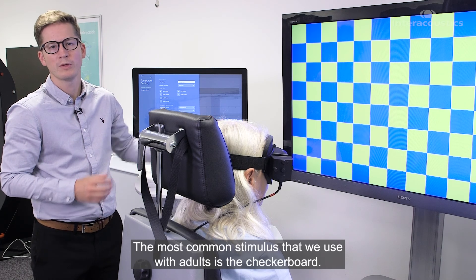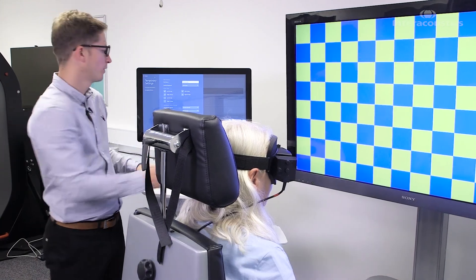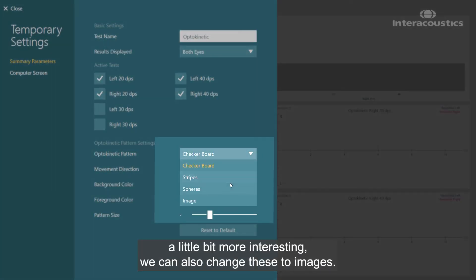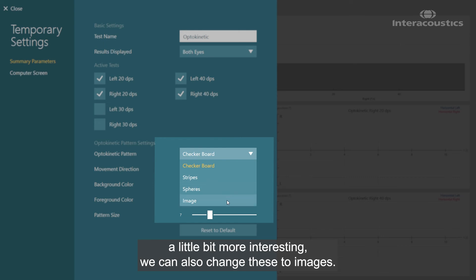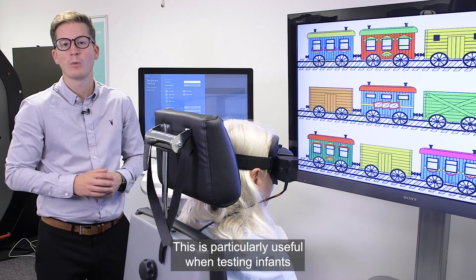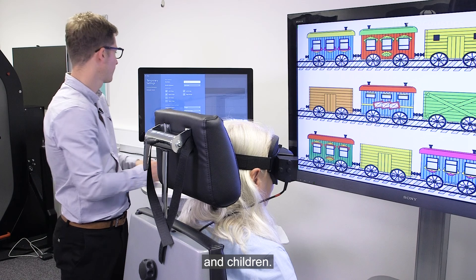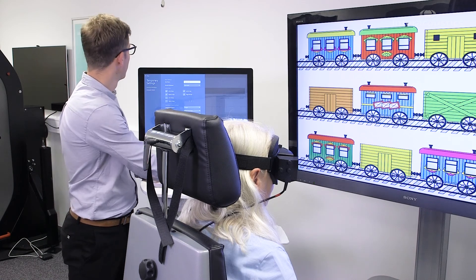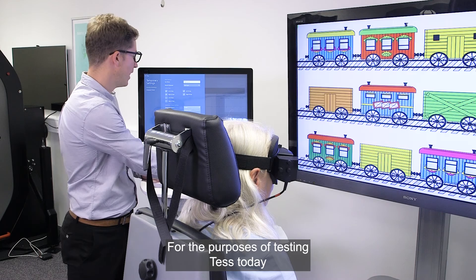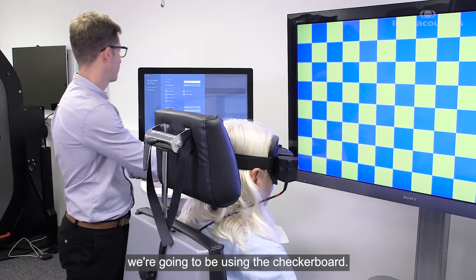The most common stimulus used with adults is the checkerboard. However, to make things more interesting, we can also change these to images — this is particularly useful when testing infants and children. For the purposes of today's testing, we're going to be using the checkerboard.